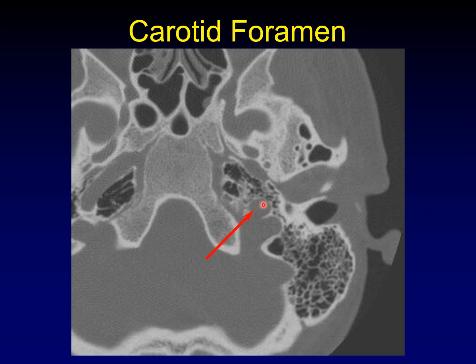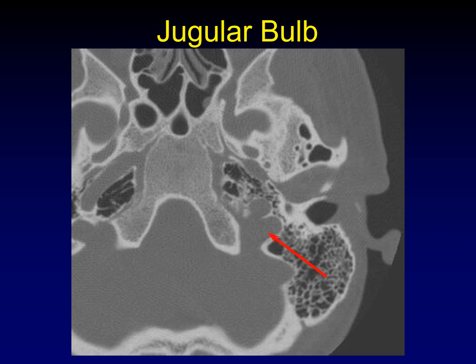This is the carotid foramen. It's going to lead into the carotid canal, which will run at about 45 degrees. Here it is on the other side — you can see its orientation. It'll run just like this in the next cut up. Right behind the carotid foramen is the jugular bulb. It's quite variable in size, and it carries not only the internal jugular vein, but also lower cranial nerves running through here.